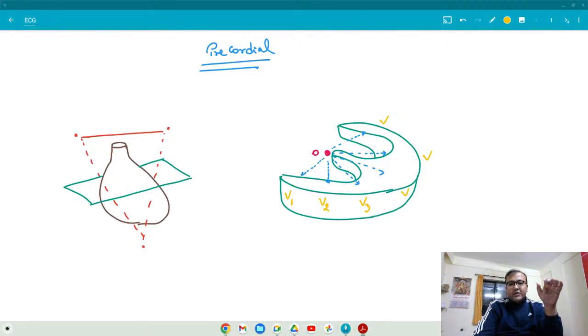So in case of V1, what is happening? Here the depolarization wave is moving towards you, or moving away from you, or first moving towards you then away, or what is happening? V1.